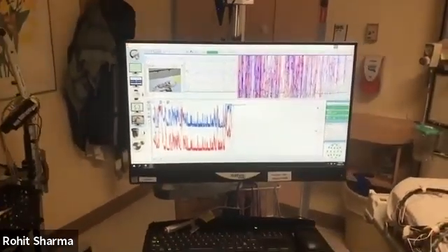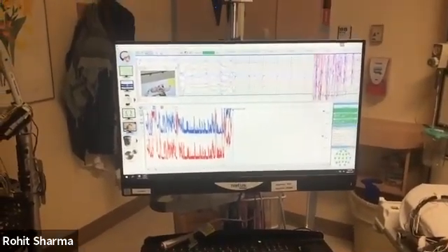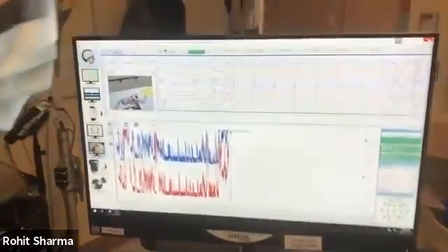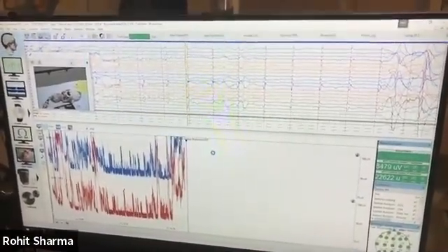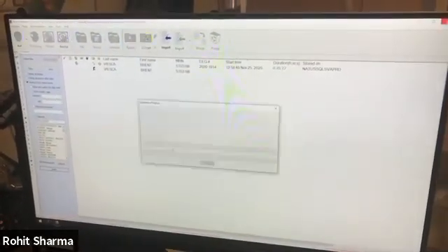Suppose you are going to transfer the patient to another room. Sometimes you guys do that, and the technology is not available. You can just shut the system down from here, just exit out, and say yes to the current study. And just shut the whole system down. It's basically a Windows computer. And then you can just shut it down from here. And you power it down. And then you can move the machine to another room.